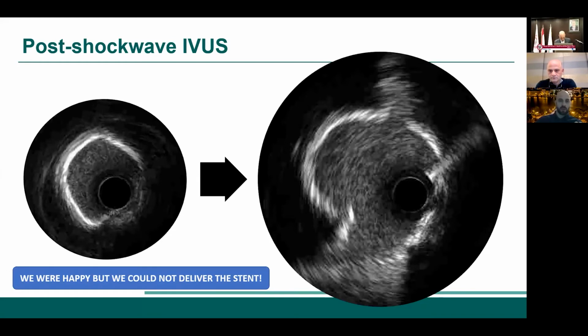I would be comfortable with trying to stent this lesion after you have used the intravascular lithotripsy and also post-dilated after shockwave treatment. And you can clearly see on the IVUS that the lesion is cracked. So I see no rationale for further rotablation. Yes. Excellent comment.